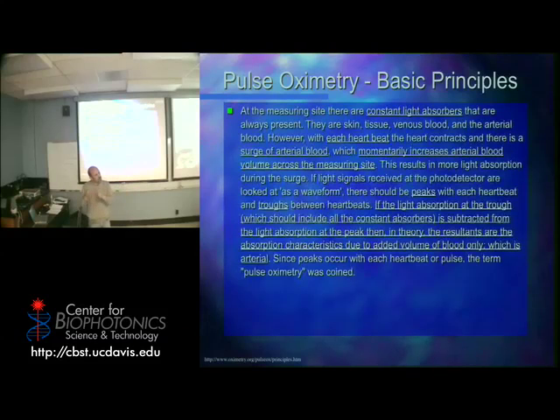So as they started messing around more and more with the light and having these lights that were controllable. Because remember, before, what did they have to do? If you wanted to get a specific range of wavelengths of light, you had to have a really, really bright light to begin with, and then you had to have a filter that blocked off as much as possible of the light you didn't want to have the light that you wanted go through. So you usually had to start with a very, very warm light source, hot, okay, that you had to be constantly cooling to draw just a little bit of that energy, of those photons, to come through. So that made a lot of that experimentation tough.